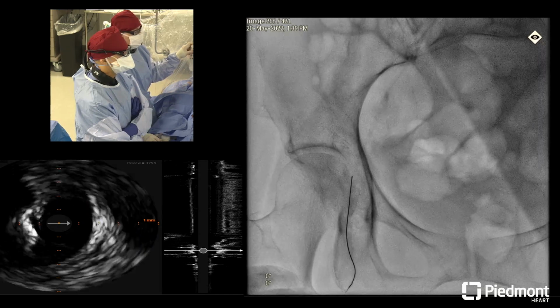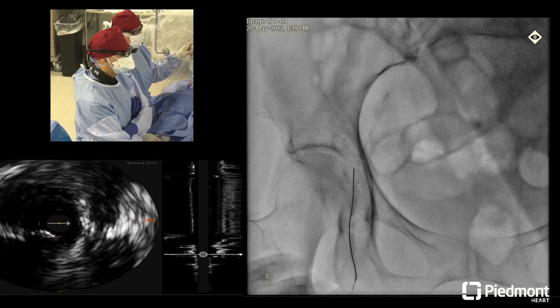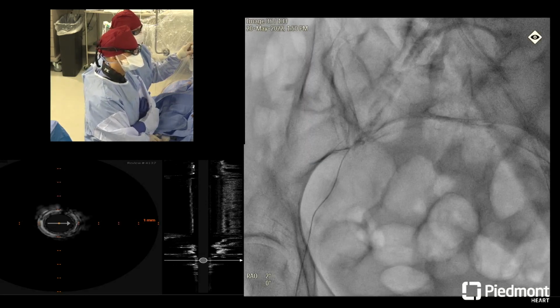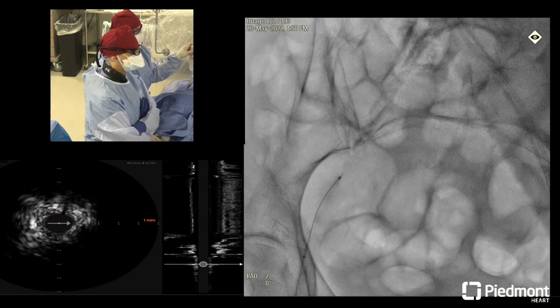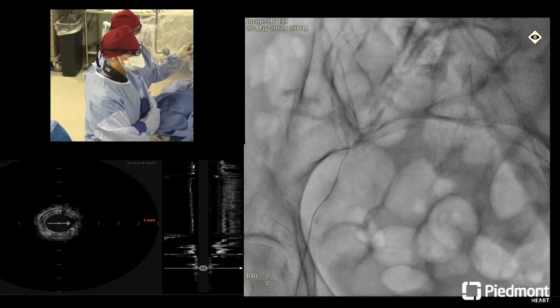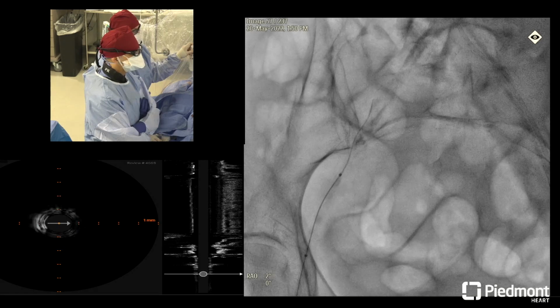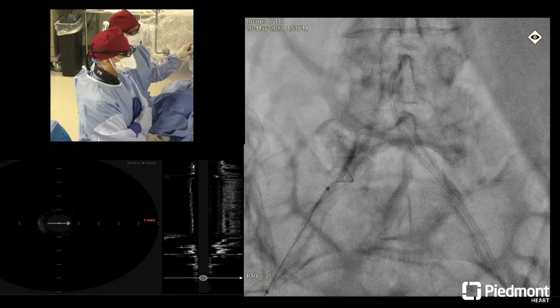So basically, using the dilator off a precision sheath, I was able to get a little bit of support, and with a little bit of time and some persistence, get my micropuncture wire up, and then I used my dilator essentially right there over the micropuncture to push through the occlusion from below, using the calcium as a guidance, hoping that we weren't outside the vessel wall at that point. We did come in from the other side. You can see that's a stiff angle glide wire with a quick cross 0.035. And so we're just traversing up.